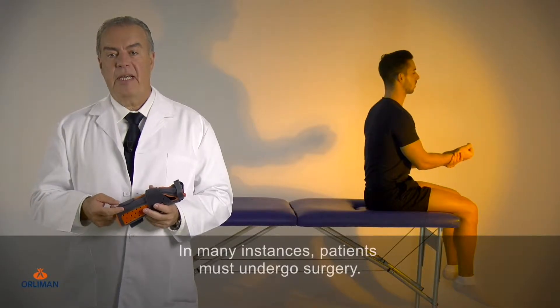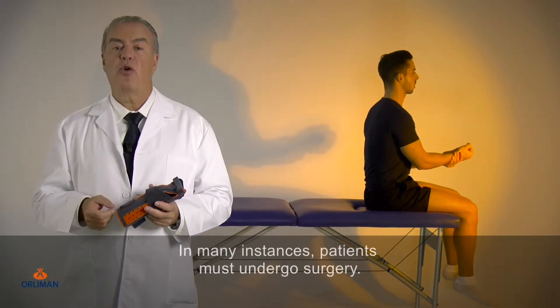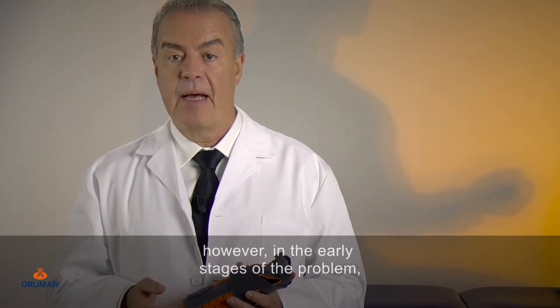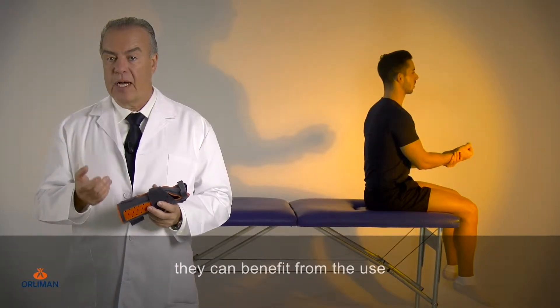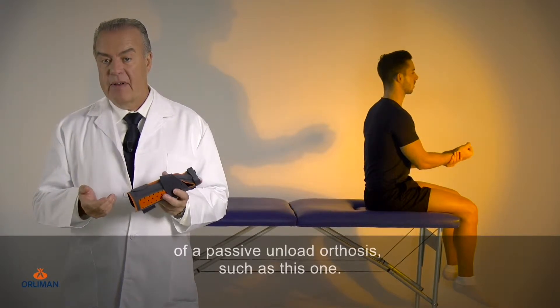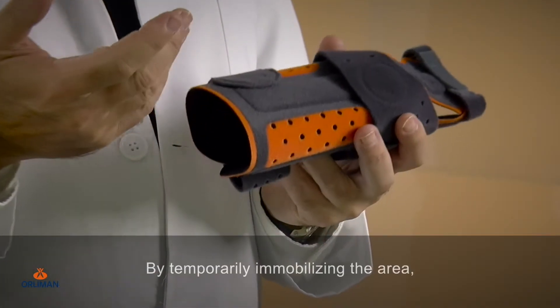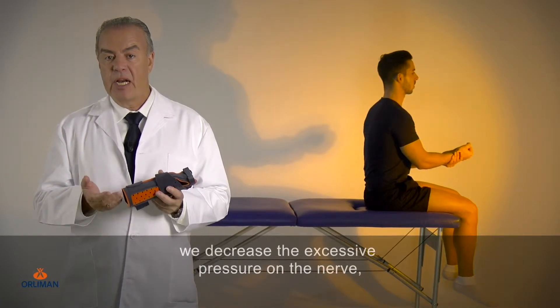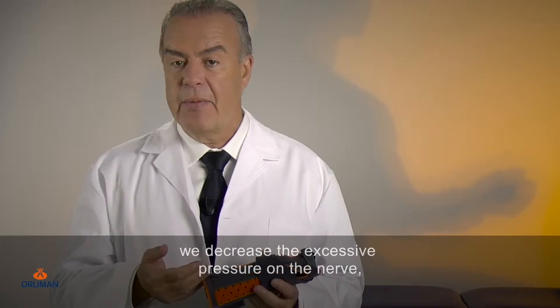In many instances, patients must undergo surgery. However, in the early stages of the problem, they can benefit from a passive unload orthosis such as this one. By temporarily immobilizing the area, we decrease the excessive pressure on the nerve, providing symptomatic relief.